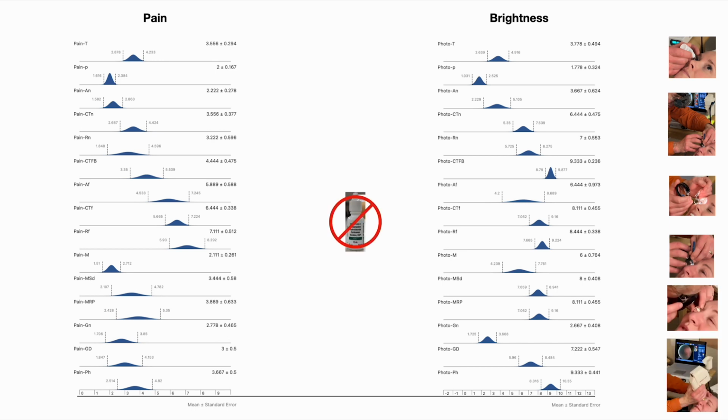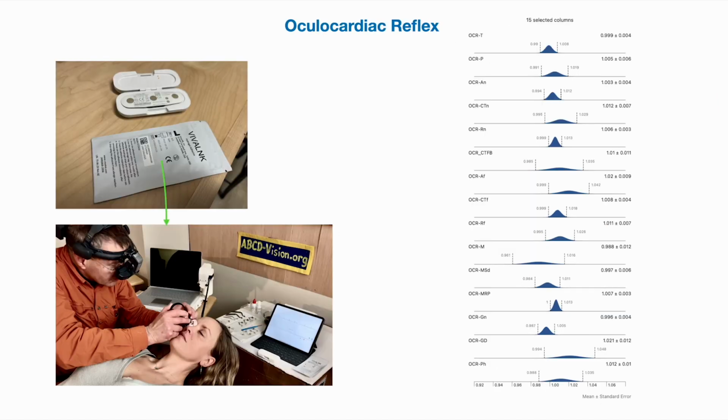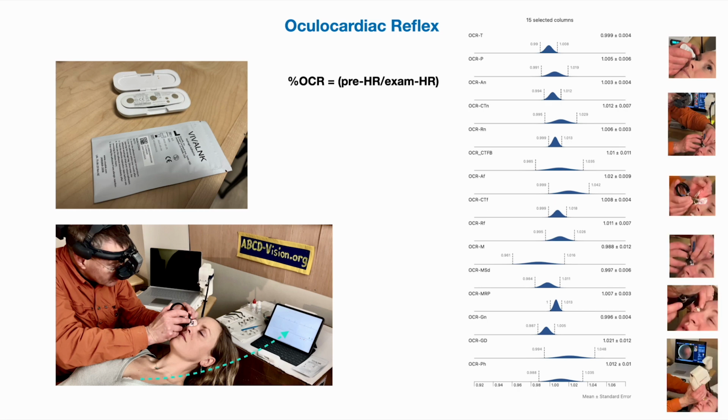For those that did not have topical anesthesia, we noticed the increased amount of pain, as with dilating drops. And for brightness, the direct ophthalmoscope, the indirect ophthalmoscope on full bright, and the Phoenix Icon were all very bright. As far as oculocardiac reflex, we measured it with a special monitor that was able to transmit information to an iPad. We measured the percent oculocardiac reflex and found with all the different maneuvers, there was a minimal difference between all of them and no significant oculocardiac reflex.